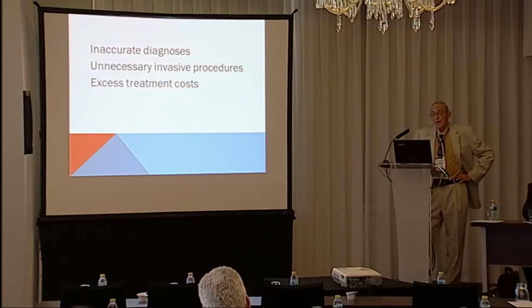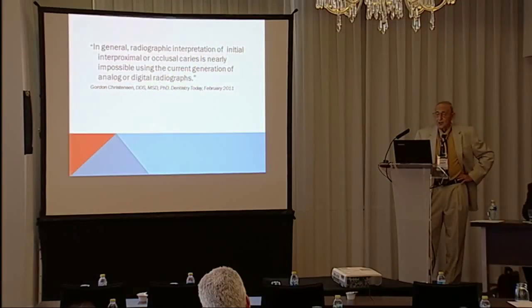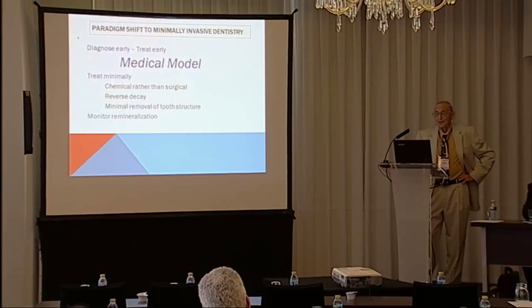With radiographs, you get inaccurate diagnosis, unnecessary invasive procedures, excessive treatment. 80% of the caries is on the occlusal. This is Christensen again. This is Lamster. This is the development.